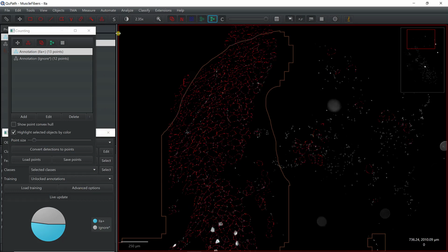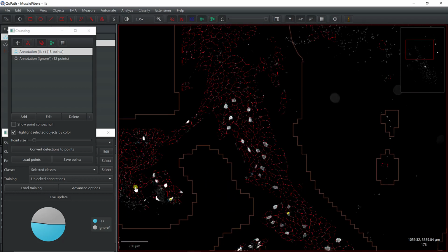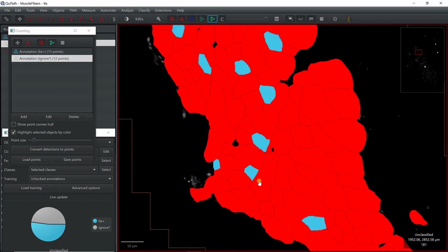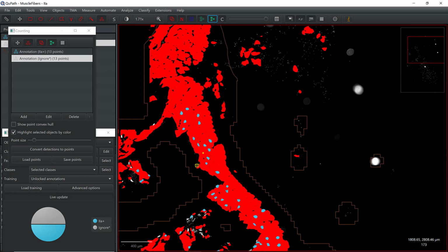Maybe just for good practice, you need to have a pretty balanced set. So it's pretty balanced, but I still have one more example. So I can give one last example of negative. So let's say this one. All right. Oh, and that one was positive, and it's actually now negative, so that was a good idea.